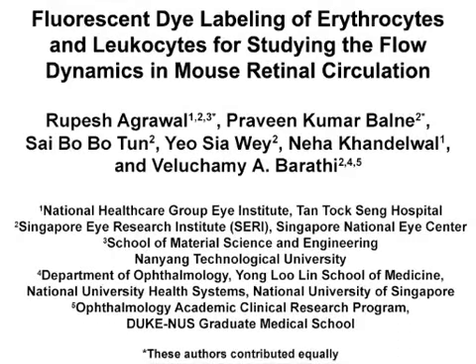The overall goal of this procedure is to visualize retinal circulation of blood cells in the mouse using a scanning laser ophthalmoscope. This method can help answer key questions about retinal diseases, such as what is the retinal flow dynamics of WBCs and RBCs, and how can their flow dynamics contribute to disease pathogenesis.